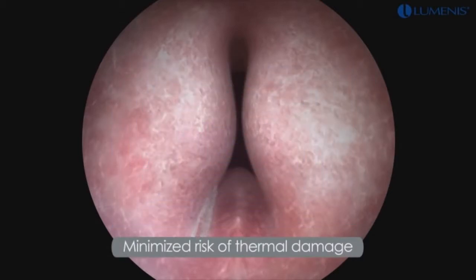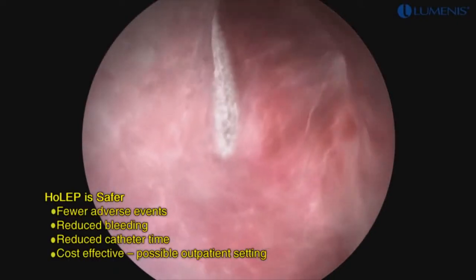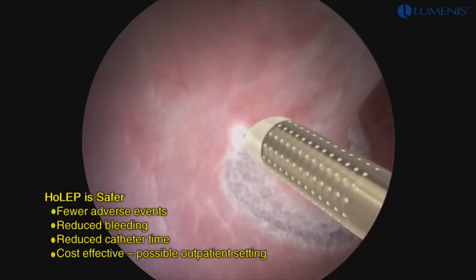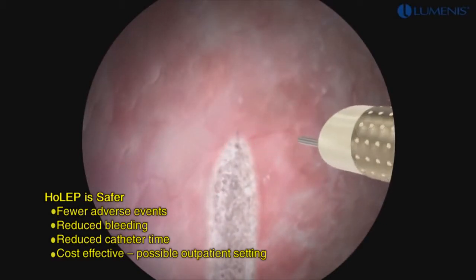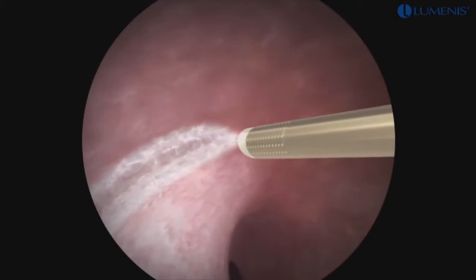Risk of thermal damage is minimized due to the Holmium laser's low penetration into the tissue. Switch back to 2 Joules and 50 to 40 Hz when away from the sphincter and continuing with the dissection. The groove should be defined initially with the tip of the laser fiber and then widened and deepened with the beak of the scope down to the level of the surgical capsule. Dissection in this plane is continued, staying between the apical tissue of the right lobe and the capsule by rotating the resectoscope in a clockwise direction during cutting. The lateral dissection continues in a circular fashion beyond the 12 o'clock position.